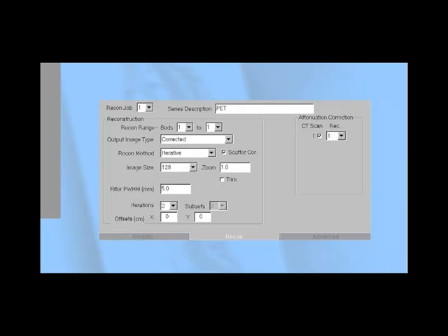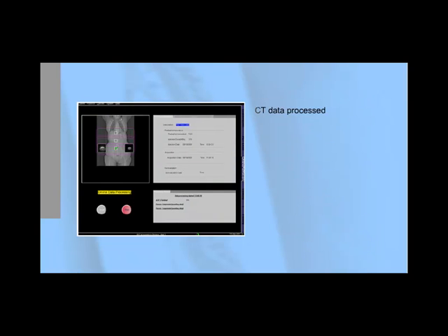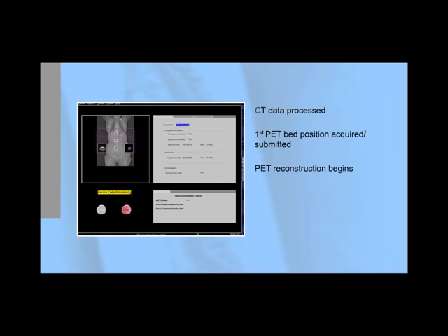Moving on to Section 4, we now come to the topic of PET reconstruction. As soon as all the CT data are processed and the first PET bed position data are acquired and submitted to the processing queue, PET data reconstruction automatically begins.